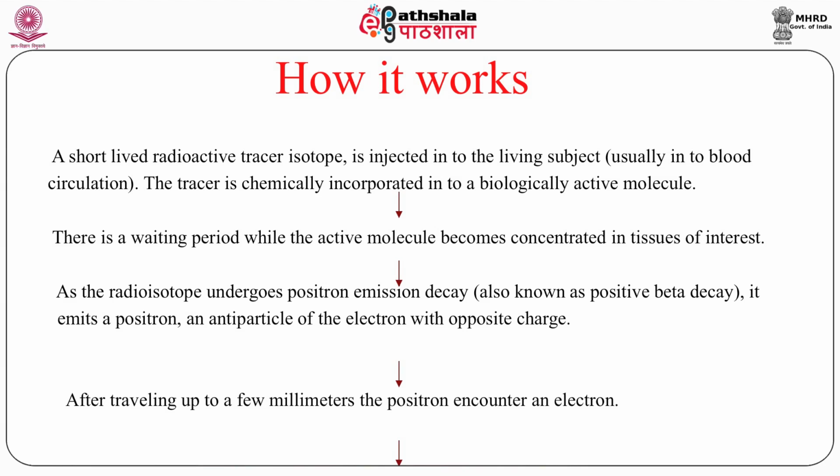Now, when the glucose is taken up by the cells, the cells won't understand whether it is sucrose, fructose, glucose or fluorodeoxyglucose. It takes it up, the cell gets energized, and what happens? Because glycolysis takes place, whatever remains trapped in the cell is fluorine-18.